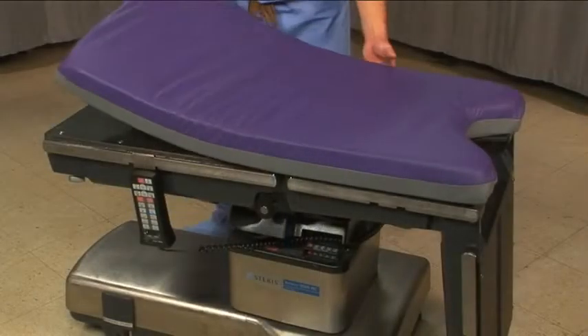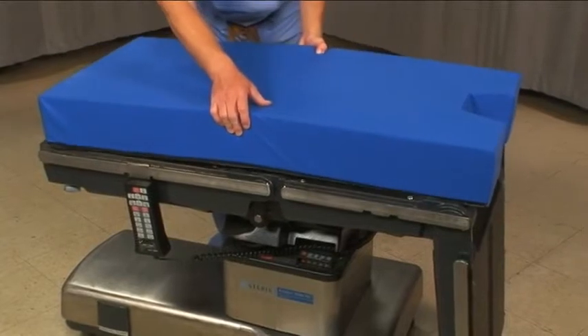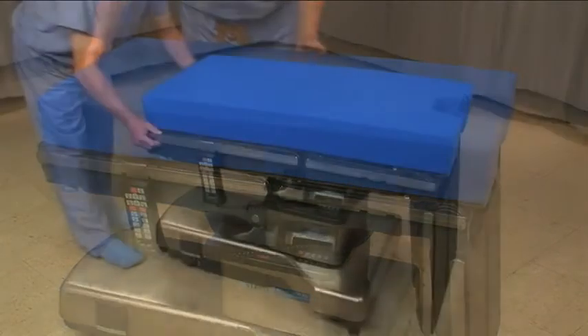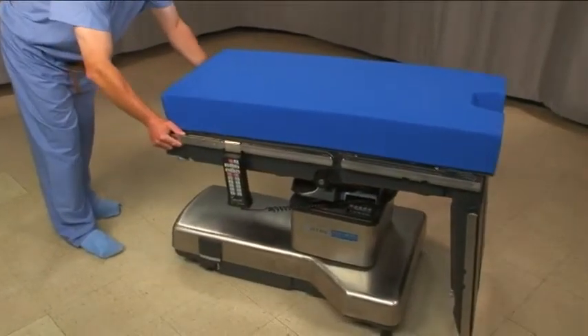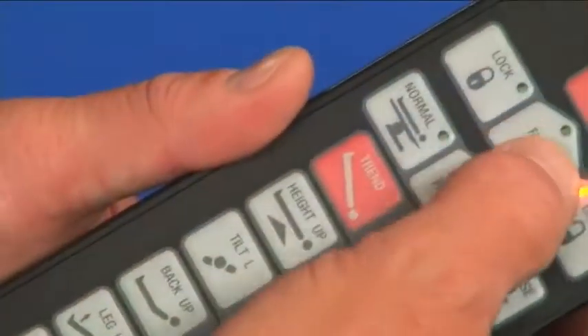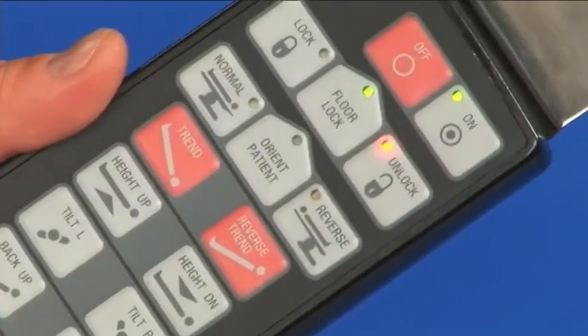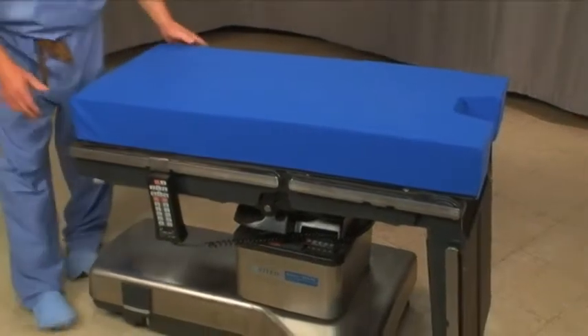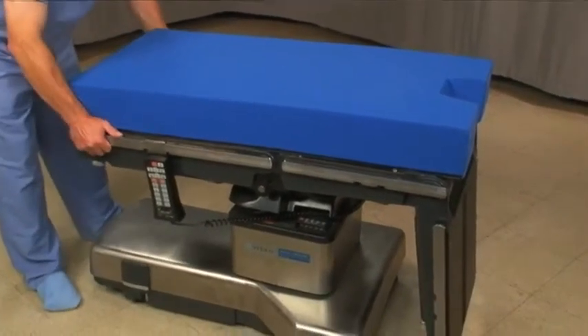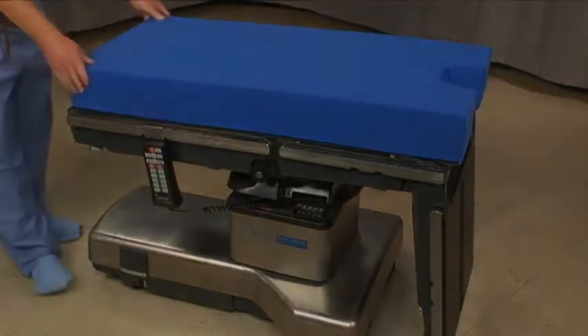You can use the spinal leg pad in place of the standard OR table pad, if you choose. Move the table down the room to make space for the FlexFrame near the anesthesia cart. Lock the table. Make sure that the floor locks are in good working condition and that the floor is level, clean, and free of debris. The FlexFrame is only as rigid as your OR table — try to use the sturdiest tables in your facility when attaching the frame.